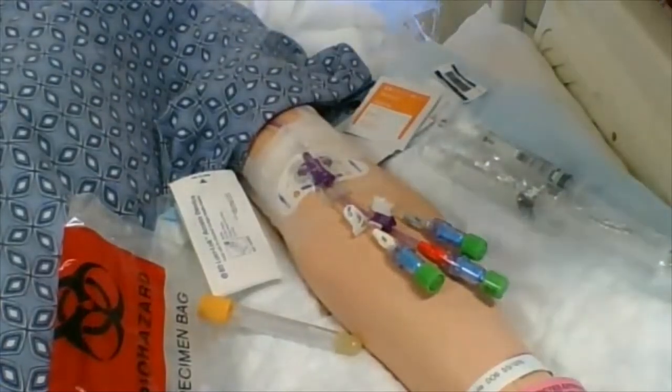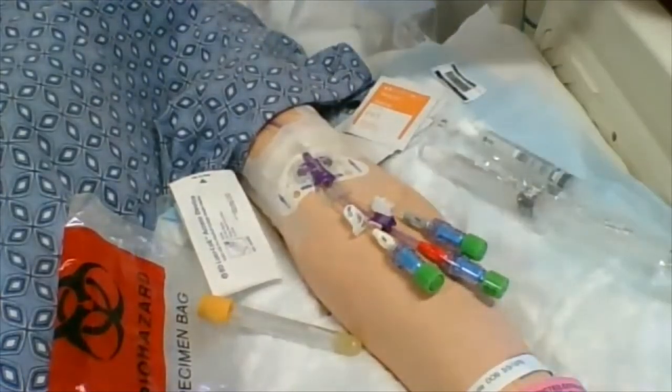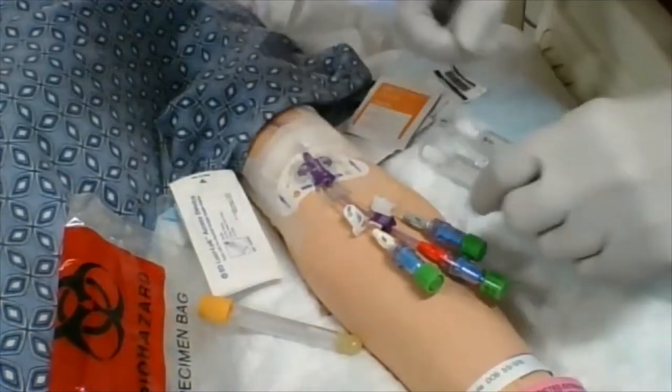If this patient is on IV fluids, we will shut them off three minutes before drawing this blood, if the patient can tolerate that. I'm going to choose a port here.